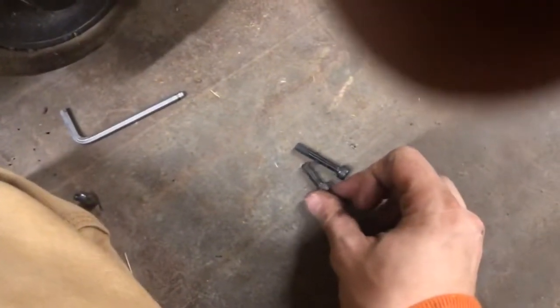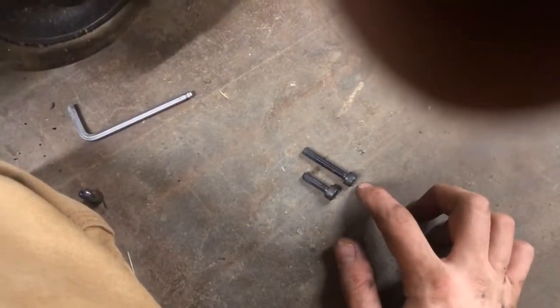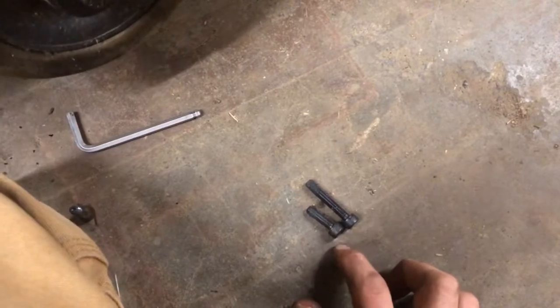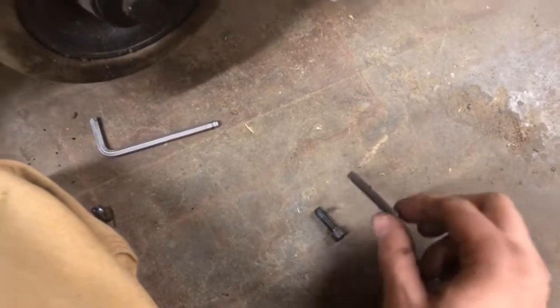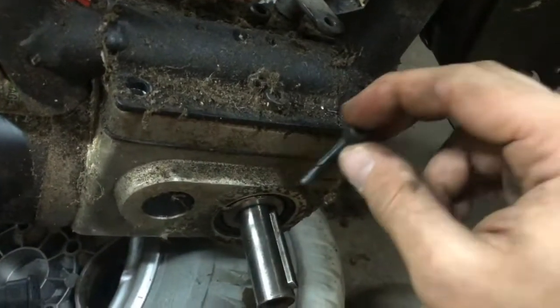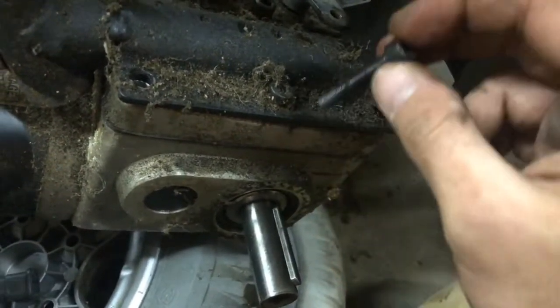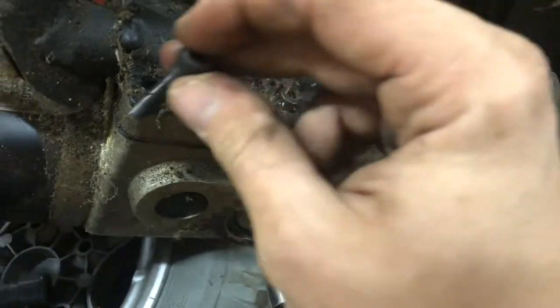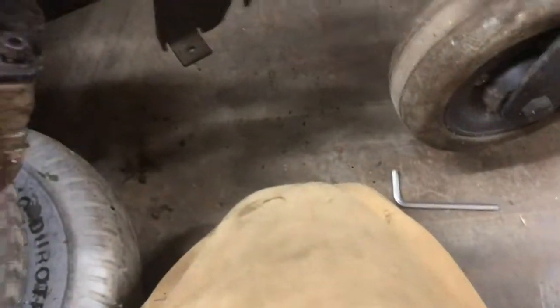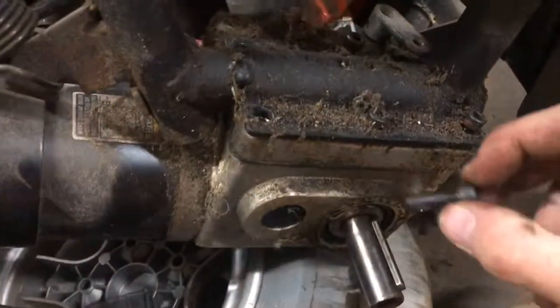And as you can tell, this was the screw I took out from the first row. This is the screw from the second. If you mess this up, you will crack your gearbox. A way you can tell which screw goes where is the three longer ones will always point towards the shaft, the motor of the gearbox, excuse me. So these right here will all be this length. The ones in the back, furthest away from the shaft, will be slightly smaller.